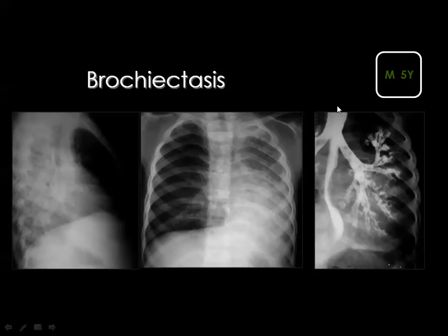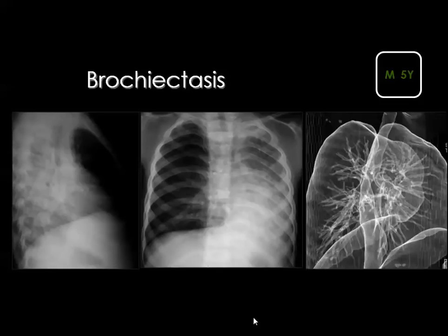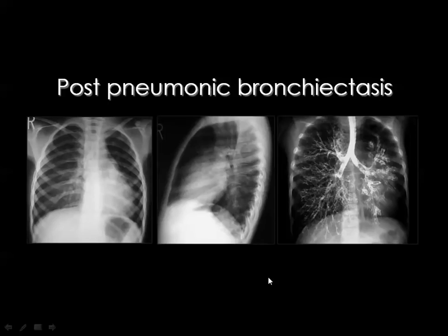And this is the old technique known as bronchography, where you inject a radiopaque material inside the trachea after doing a surface anesthesia for the tracheal mucosa. Then you see the contrast material within the dilated bronchi confirming the diagnosis of bronchiectasis. But nowadays you can see the bronchi through multi-detector CT without the need to inject contrast media or do this obsolete technique.